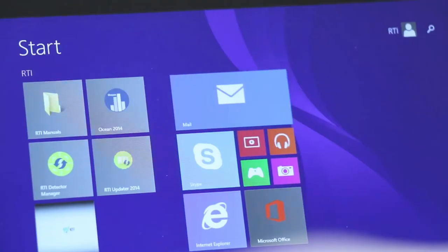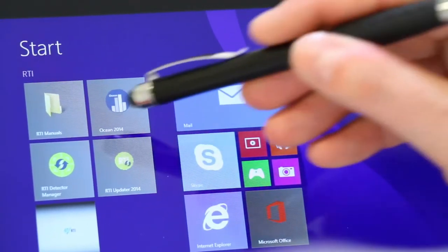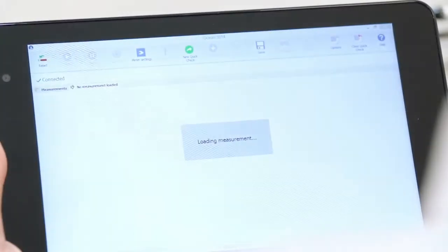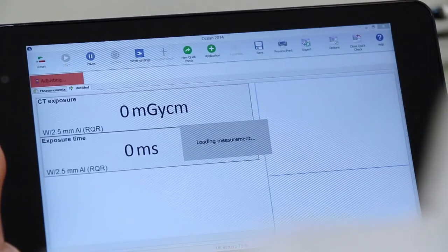Ocean will automatically connect to the piranha. Thanks to its plug and play function, Ocean immediately starts to adapt to the optimal settings for measuring with the ion chamber.